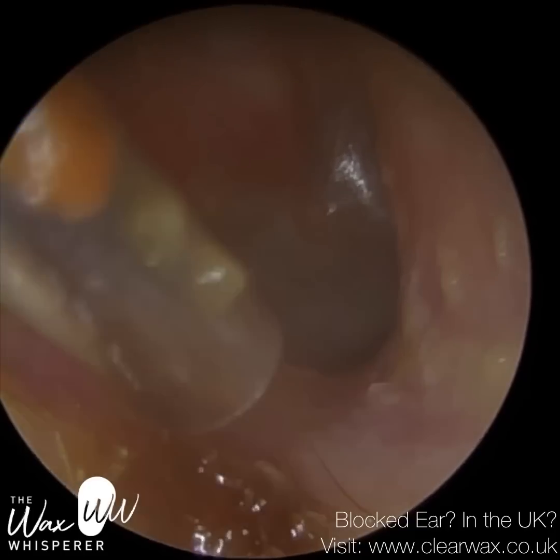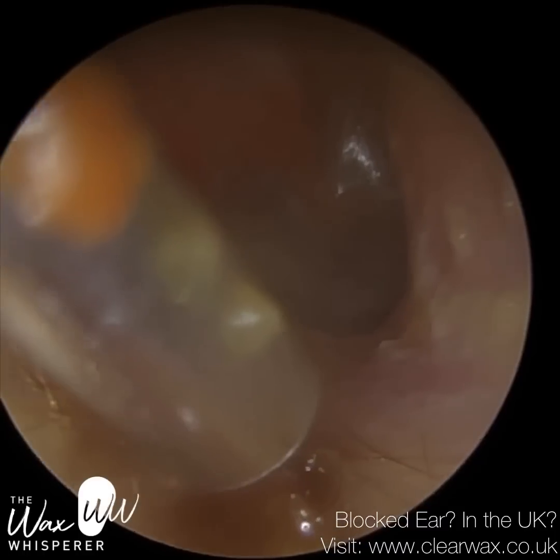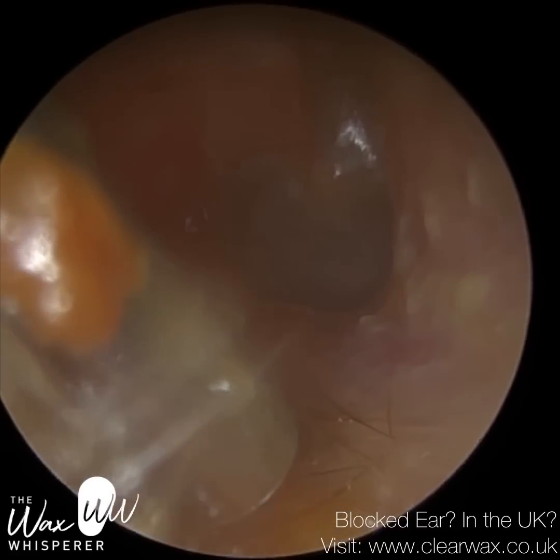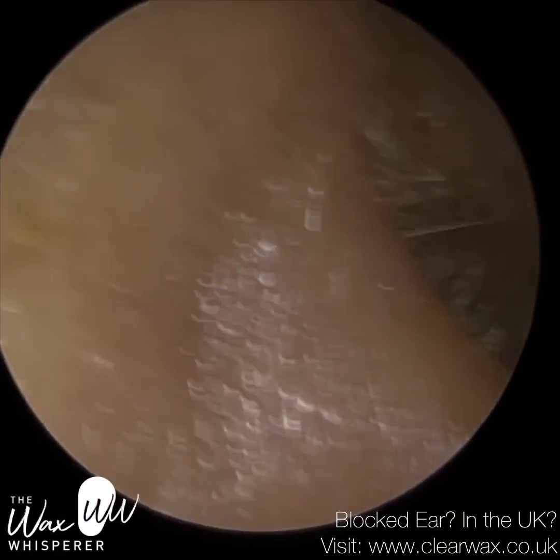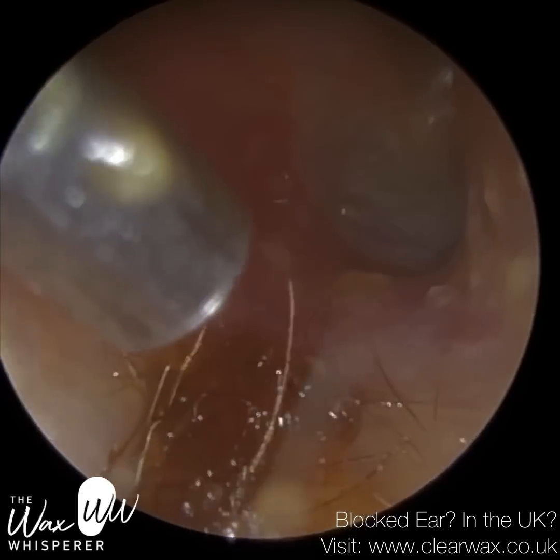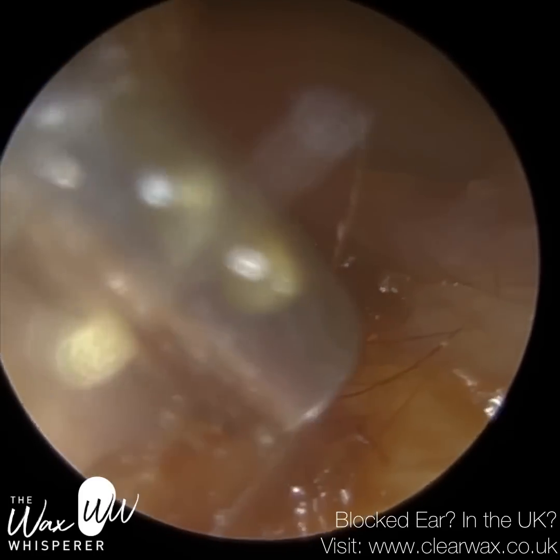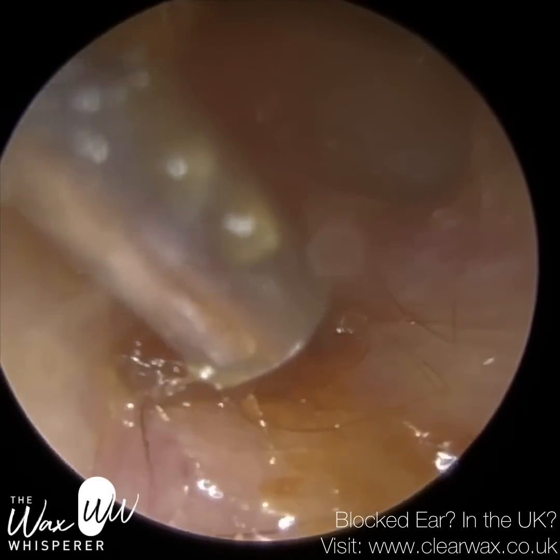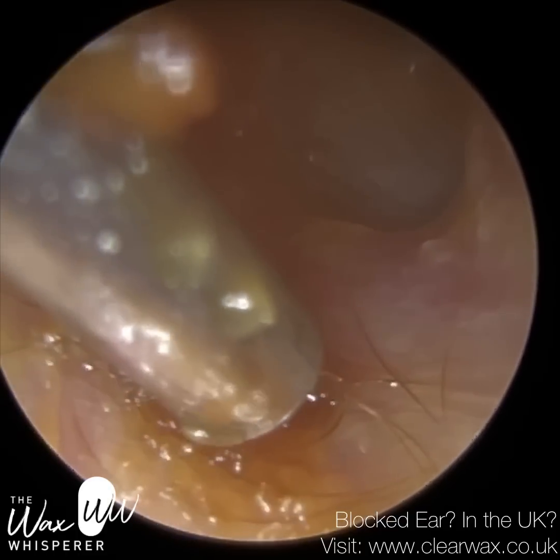In addition, the water produced by the sodium bicarbonate drops gets absorbed by the skin cells, which make up roughly 60% of earwax. The skin cells hydrate, they swell, and eventually they burst from the membranes. That process of maceration of the skin, the overhydration and swelling of it, and eventually the breaking down of the skin, can cause very sticky, mushy wax. So I've just put loads of olive oil in there just to change the consistency. It really helped. It also has stopped the inside of the suction tube getting blocked. When you've got sticky, mushy wax, it can often block the inside of the sucker.